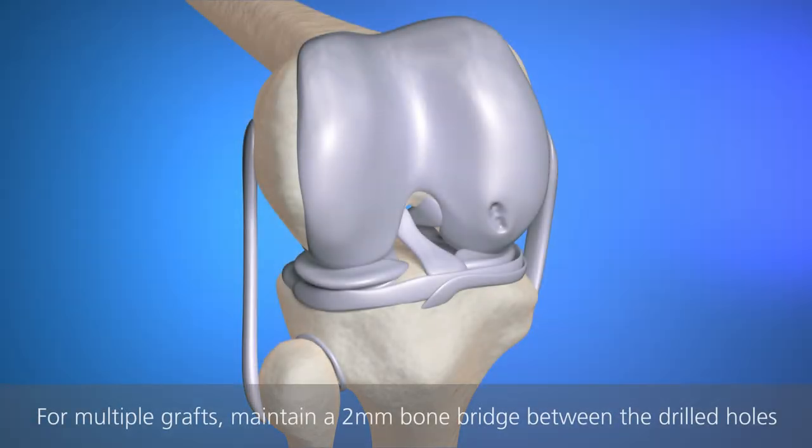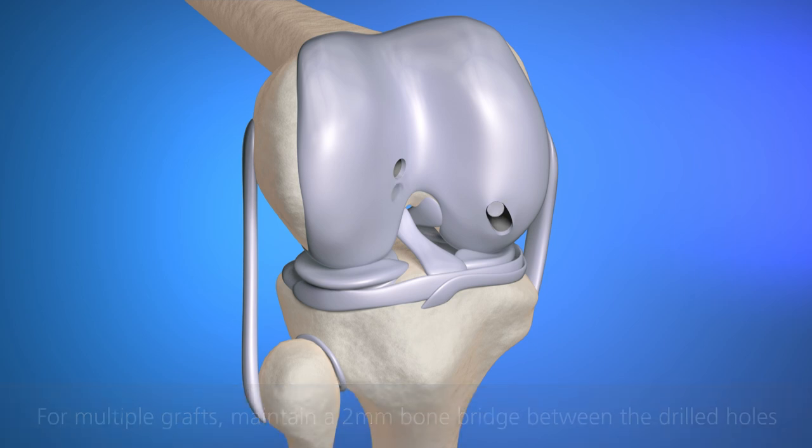Multiple grafts may be used depending on defect size. If multiple grafts are required, maintain a 2 mm bone bridge between holes for a secure graft press fit. A second graft is placed.